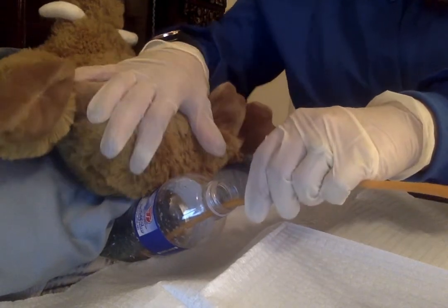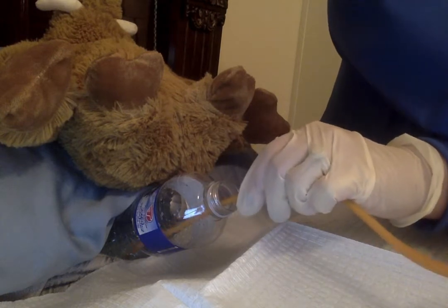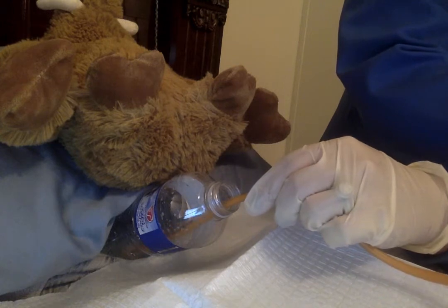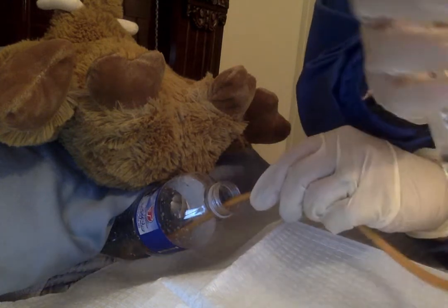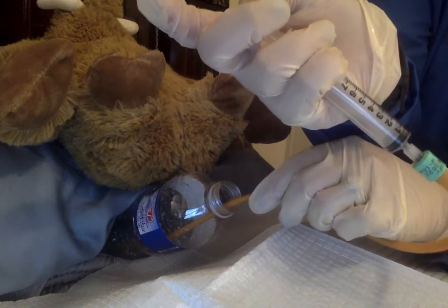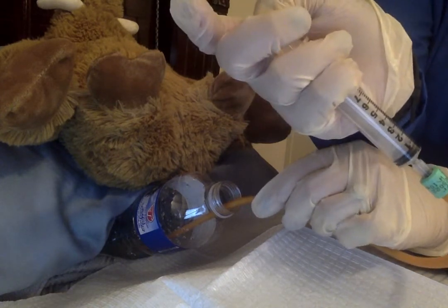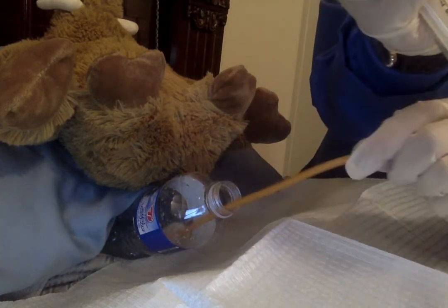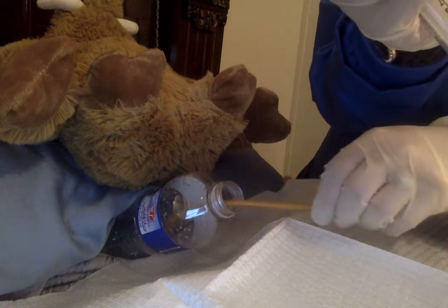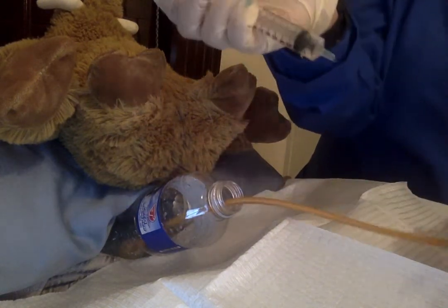Now, we're going to take our non-sterile hand, we're going to push and make sure that we got all of this liquid into the port. And then with our sterile hand, we're going to pull back and make sure that it's in place, and it is, and we're going to push back in an inch or so. And then we are done.